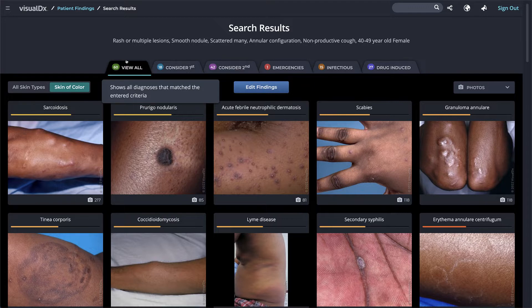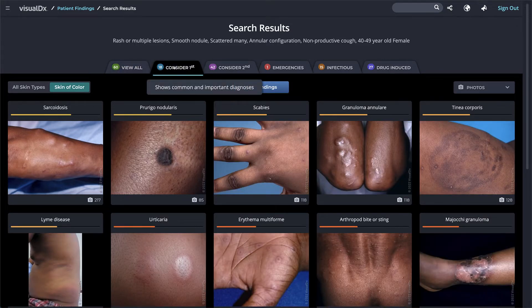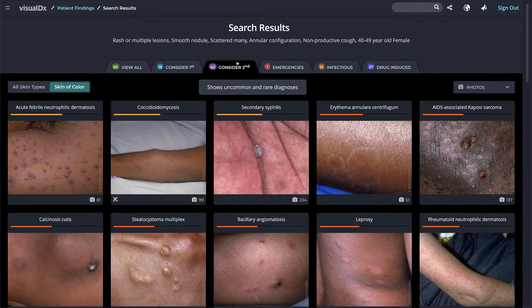The green 60 tells us there are 60 possible diagnoses in the differential that can match the findings entered. Consider First shows the most common and important diagnoses. Consider Second shows uncommon and rare diagnoses.